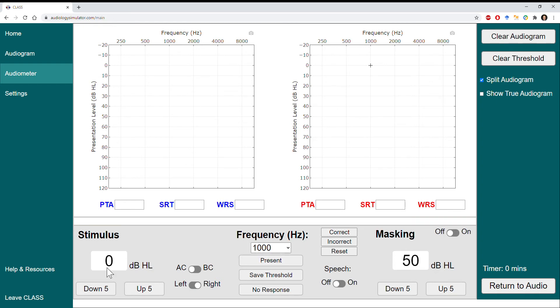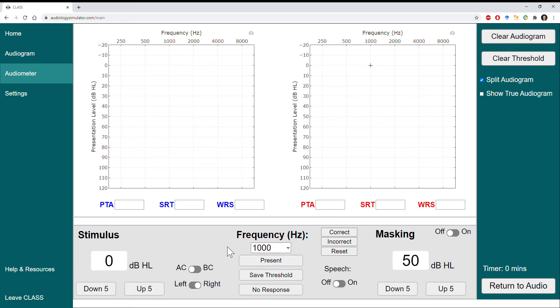So we'll increase in 5 dB increments until we find a level where the patient responds. We'll repeat this procedure by going down 10, confirming that there's no response, and then increasing in 5 dB intervals until we see a response. At this point, the patient has responded at 0 dB HL three times out of three presentations with no correct responses at any presentation below that, and we would save this as our threshold for the right ear at 1000 Hz.